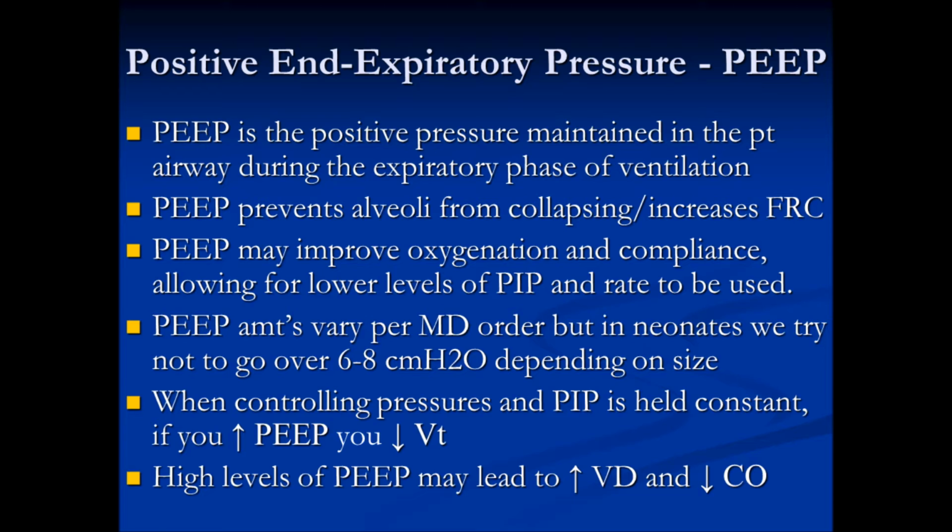Hopefully you remember that from first semester, when we talked about time constants and things of that nature. So if you already start off with the alveoli that is already full or has already started to fill because you never let it get down to baseline, then it doesn't have far to go to get to its filling capacity.